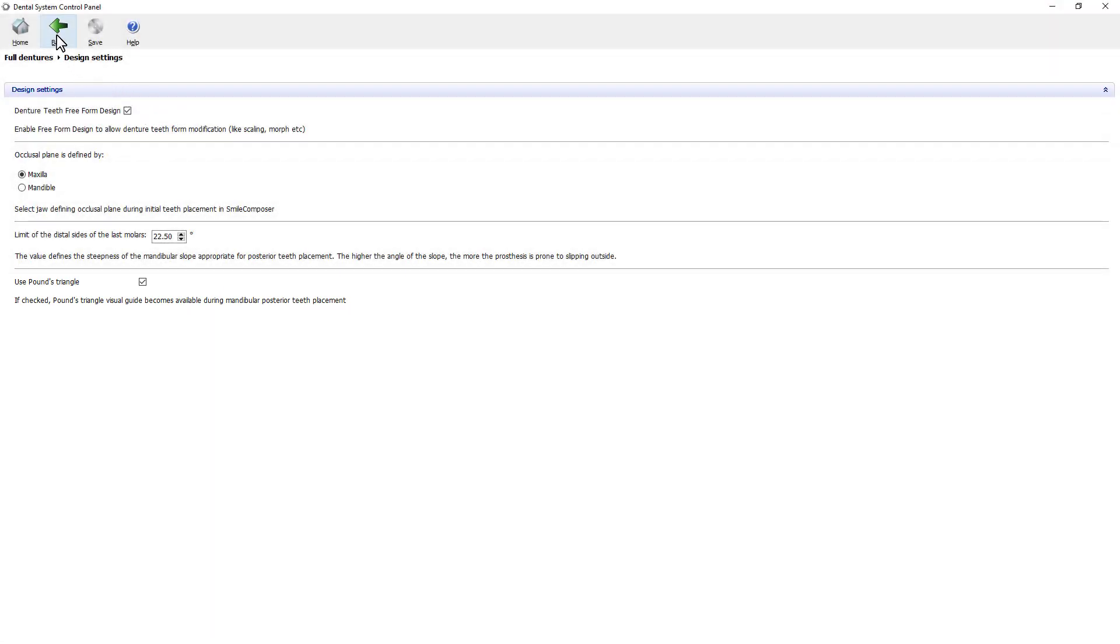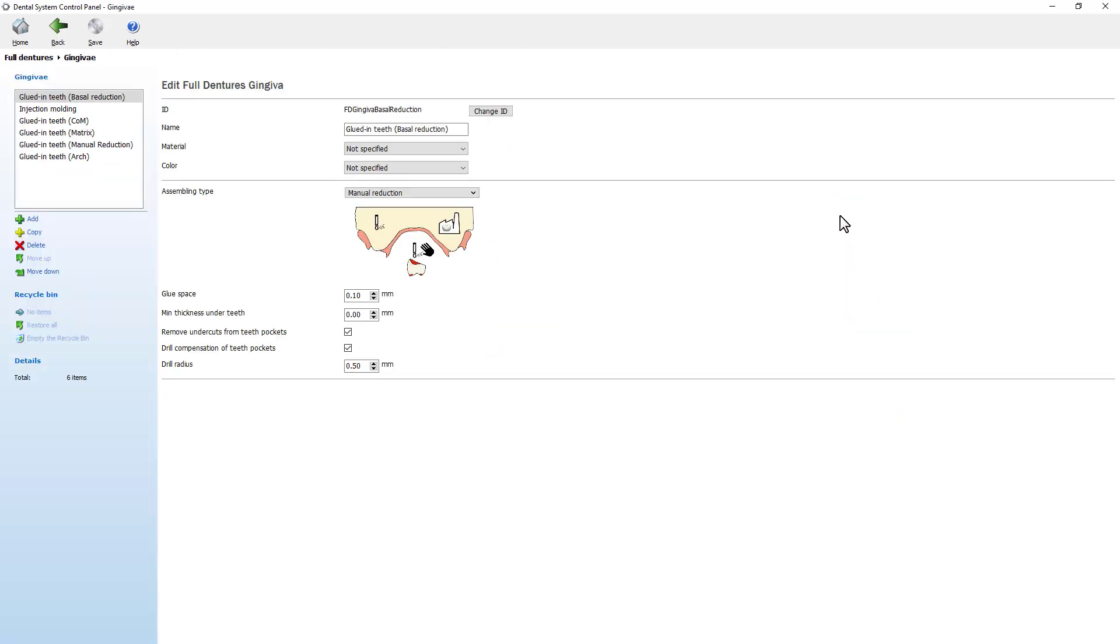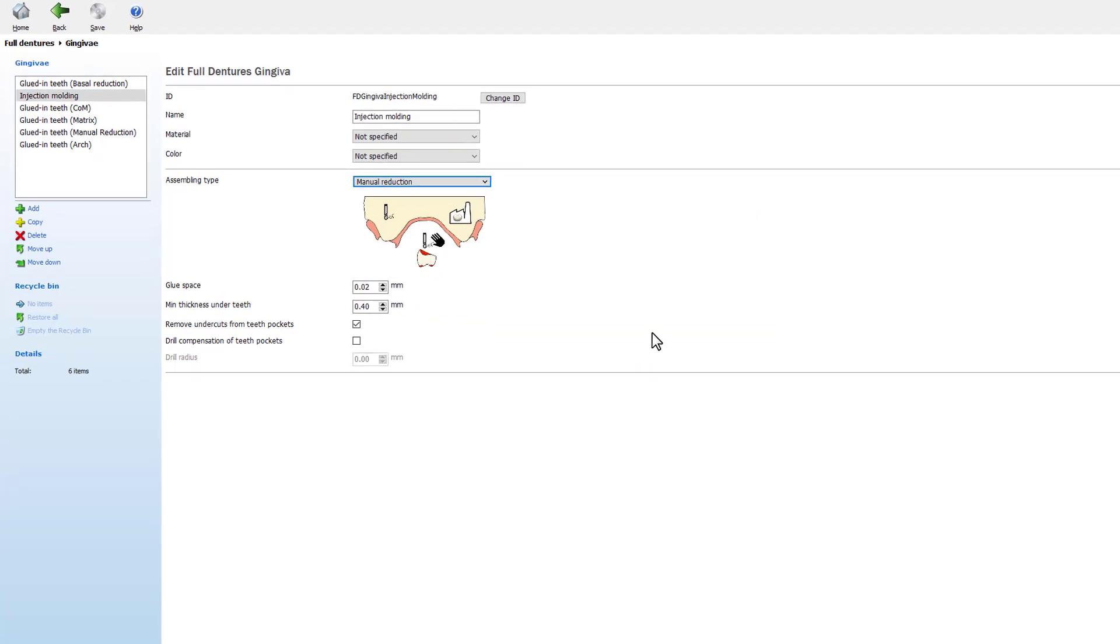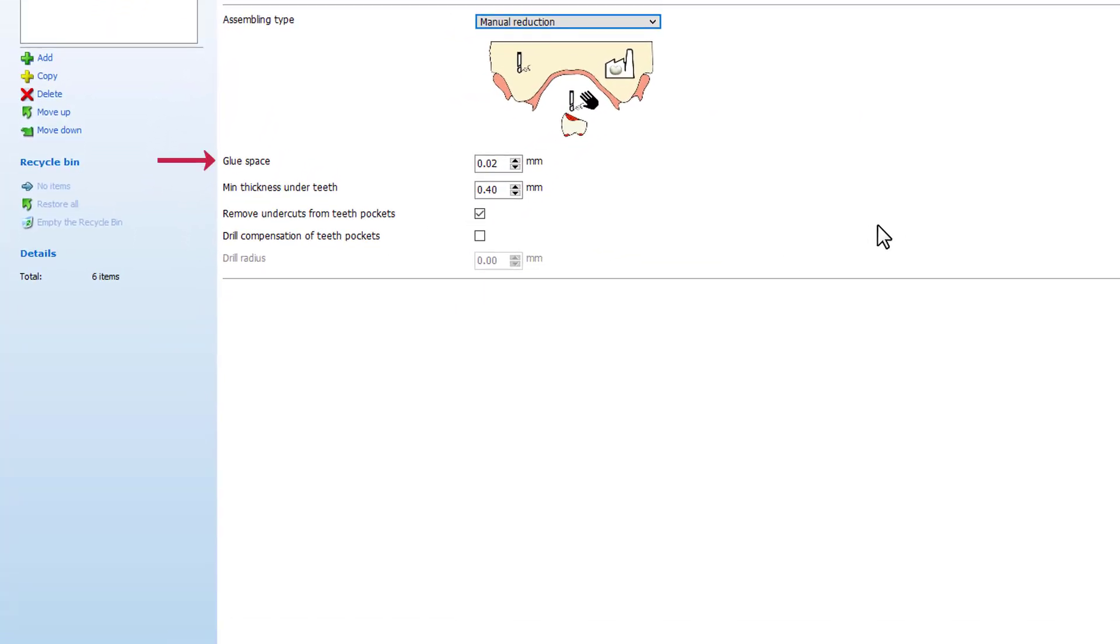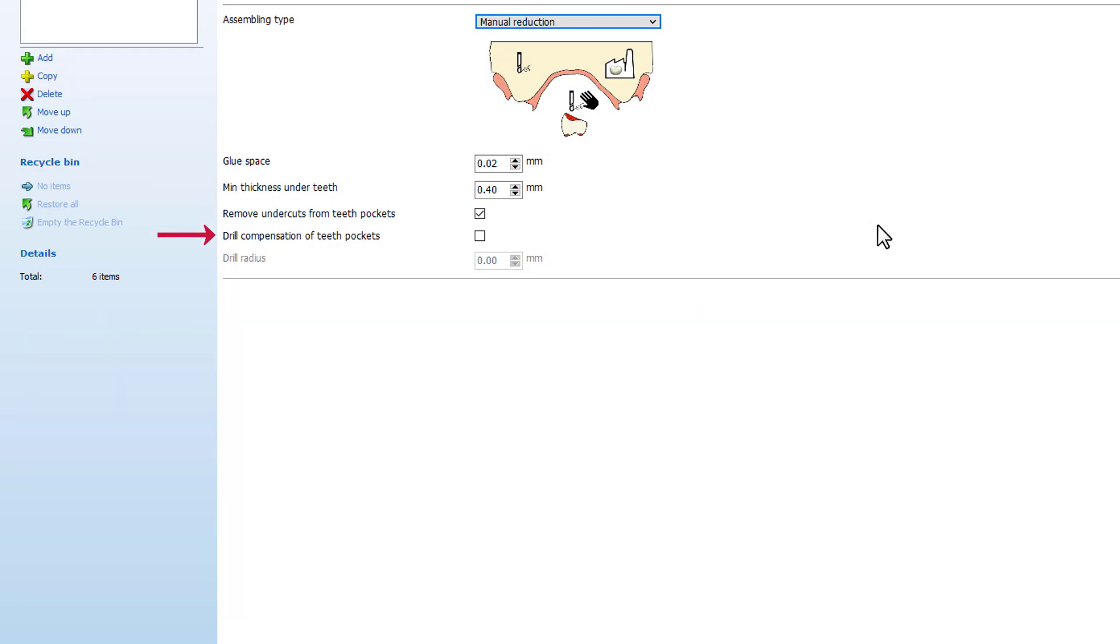Now going to the gingiva page, we can change the pre-configured parameters for full dental design such as assembling type, which provides a list of different assembling methods, glue space that controls the amount of distance between each tooth and its placeholder surface in the denture base. You can also set the minimal thickness under teeth and the drilling options.